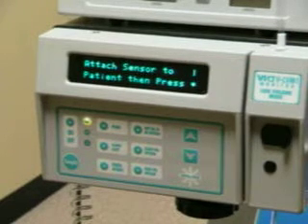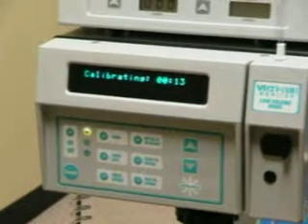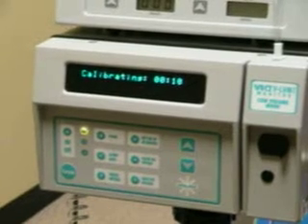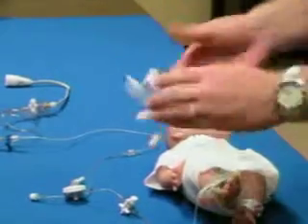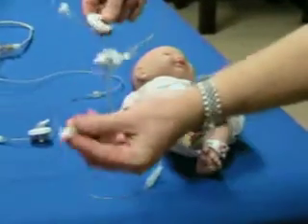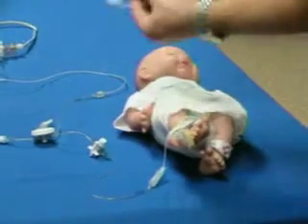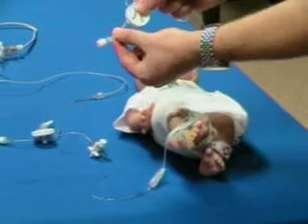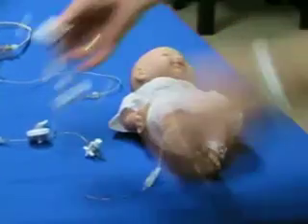So we're going to go over here to our patient, which is already set up. And in the other video we went through the priming of the extension set here. But if you remember, we had 5 packages in the sensor kit. So package number 4 is the extension set. And you can set this up on the patient anytime before the calibration of the monitor. It's provided sterile. We've got our transducer end and our patient end. And then we've got our sensor connection and our collection bag connection. So that's how it comes out of the package.